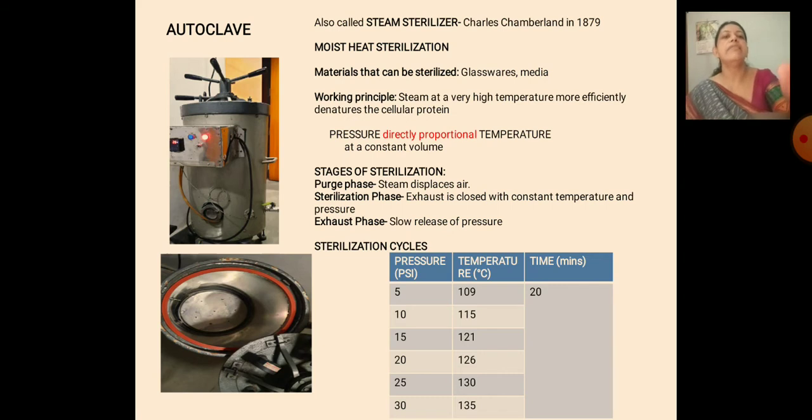Now here are the various sterilization cycles. You see the pressure over here, along with the pressure how the temperature rises, and accordingly we can sterilize it.